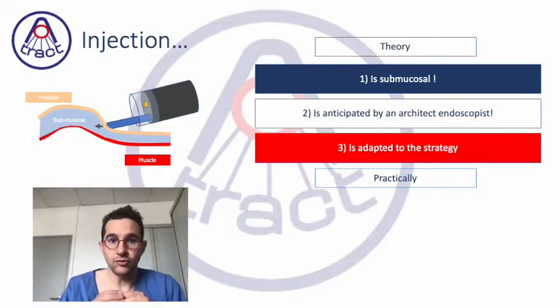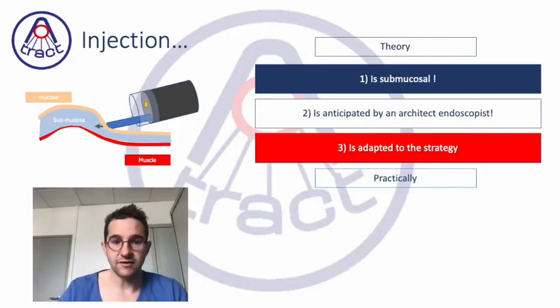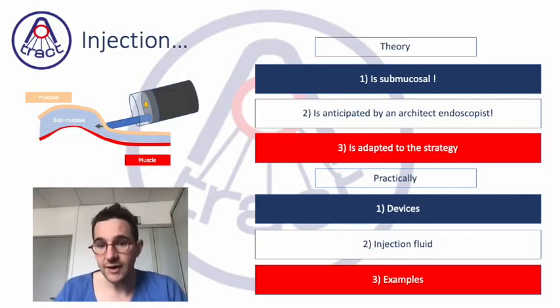It means that you have to have a strategy to predict what will be the best strategy for your resection, and use the injection to help this strategy to be as effective as possible. And practically, we will see the devices, the injection fluids, and some examples of injection.